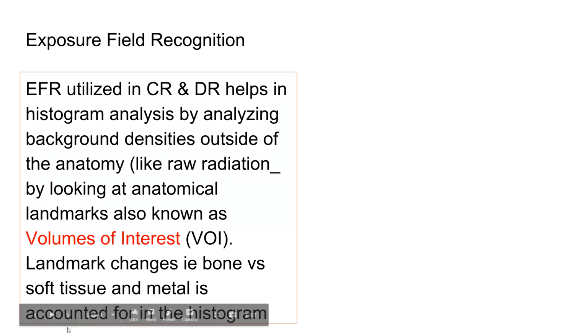All this stuff will be accounted for, and you'll see in a couple seconds, in your histogram. And of course, you can't go into your computer and actually pull out something that looks like a graph, right? So we're using this representation of your histogram as something that looks like a bar graph, when in reality, it's memory locations in your computer, right? It just helps to see it graphically for us to understand what's happening.